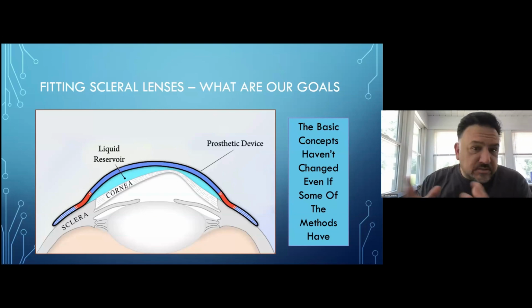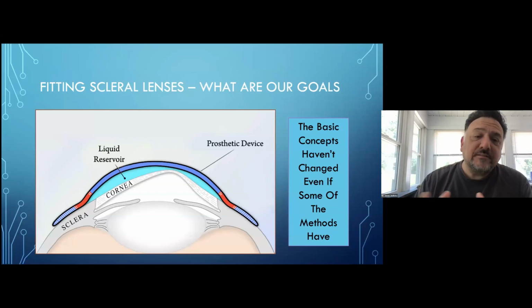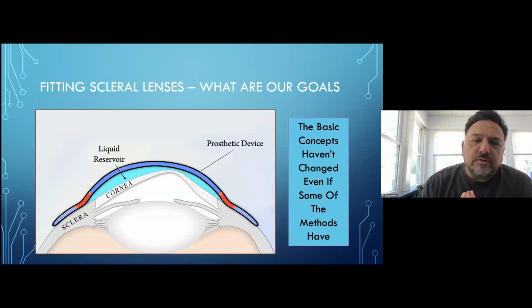We've done some work. We've either put some diagnostic lenses on, we've taken some maps and used those maps to create a lens, or we've taken an impression of the eye and made a lens from that perspective. And then we've ordered that lens and dispensed it. We put it on the patient's eye. There's a variety of different ways we can get to that point. But once we've actually got that first lens on the patient's eye, then it comes down to our skill as fitters: how do we recognize the issues with our fit? Because no matter how you go about it, you're always going to have the potential for modification, right?